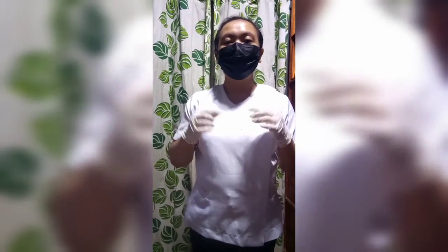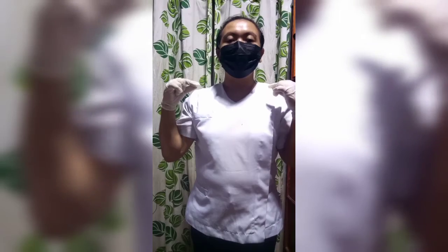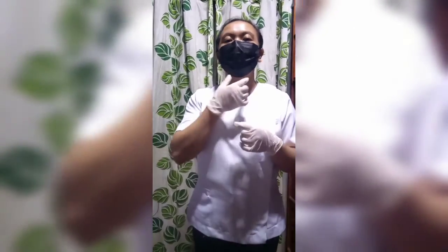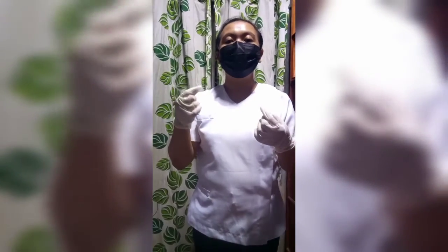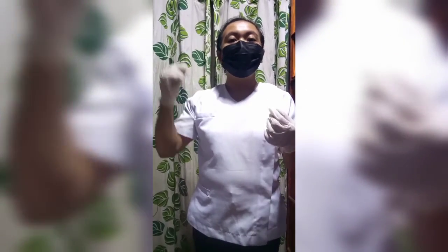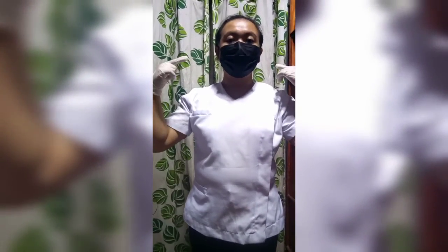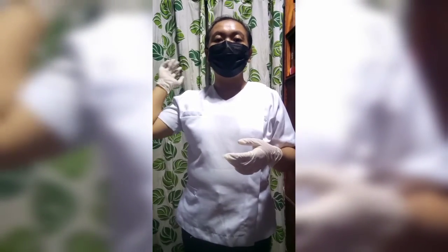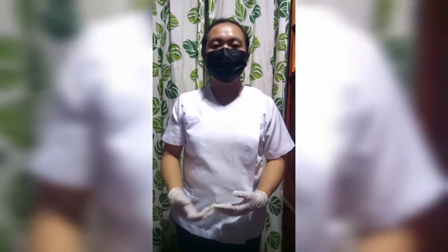Place tubing over and behind each ear with the adjuster comfortably under the chin. Alternately, the tubing may be placed around the patient's head with the adjuster at the back or at the base of the head. Place a gauze pad at the ear beneath the tubing as necessary.